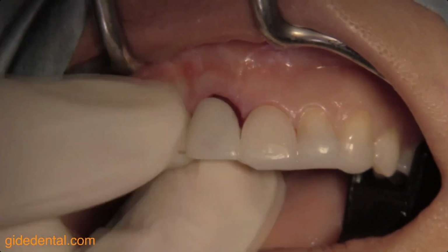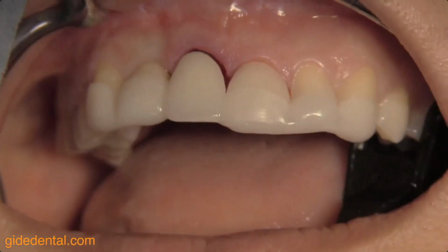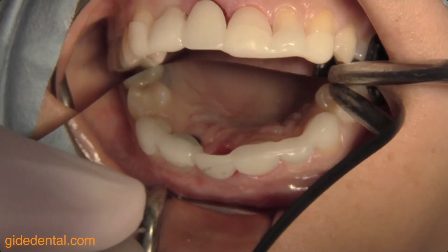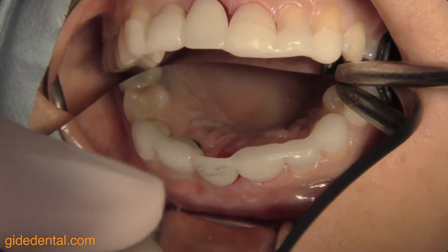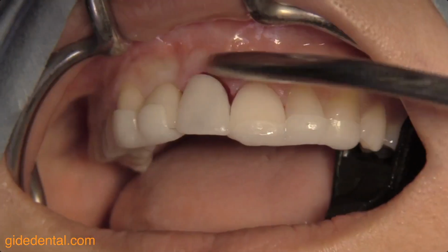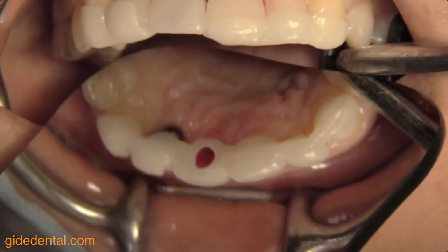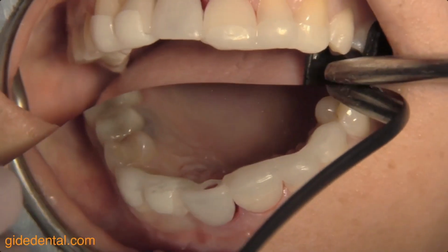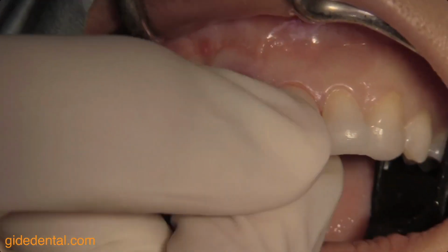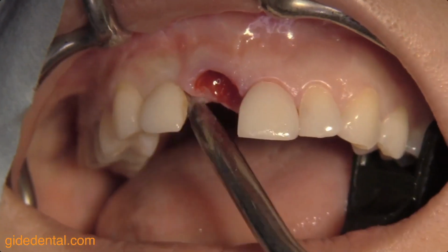You can see how we have duplicated nicely the gingival margin. You see that's perfect. So on the number 8, on the central incisor, the position looks really nice. Here you can see the palatal opening. So we have to make sure that, of course, the implant emergence will be palatal to that incisal edge. Here you can see our second surgical guide, or it could be the temporary shell, which was also laboratory fabricated, and which we're going to be using to stabilize, of course, the temporary to the implant, which we're going to be placing.